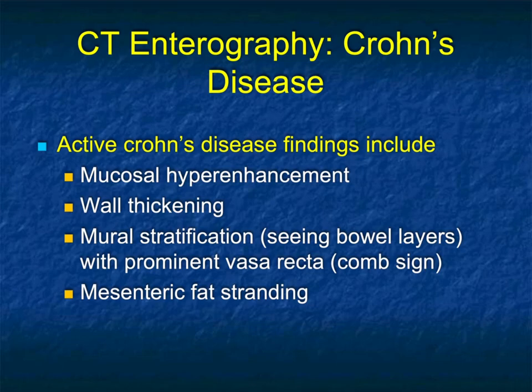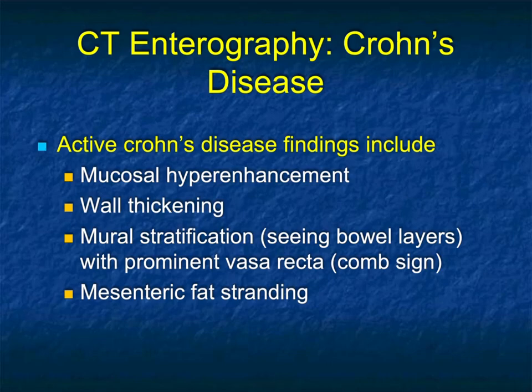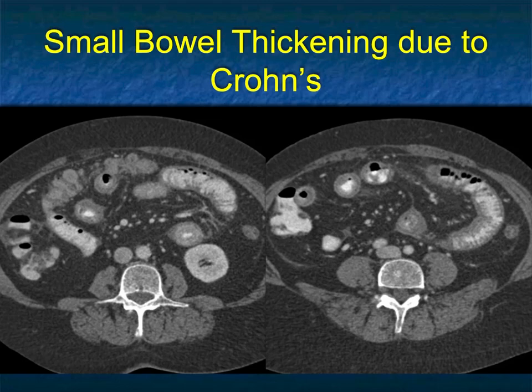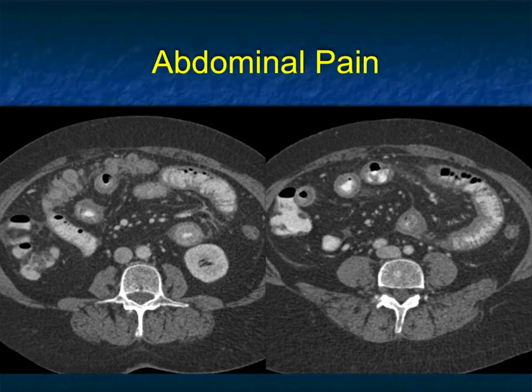We also see many patients in the ER with Crohn's disease or suspected Crohn's disease. Crohn's disease is a very classic disease process in terms of CT — we've published a lot about it. We look for mucosal hyperenhancement, wall thickening over three millimeters, mural stratification with three bowel layers, the prominent vasa recta giving the comb sign, and commonly mesenteric fat stranding. Here's a nice example with positive oral contrast showing thickened dilated loops of bowel and fibro-fatty proliferation of the mesentery. That cross-sectional appearance is not specific for Crohn's — it can also be seen in ischemia or other changes.